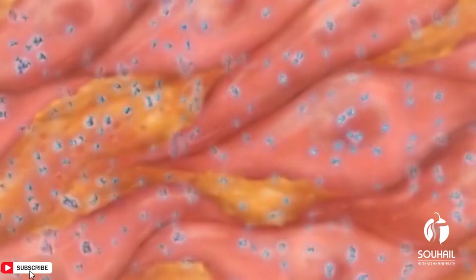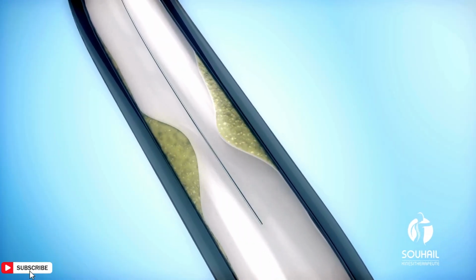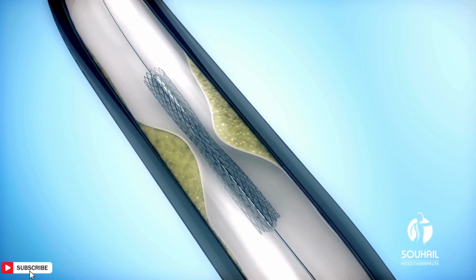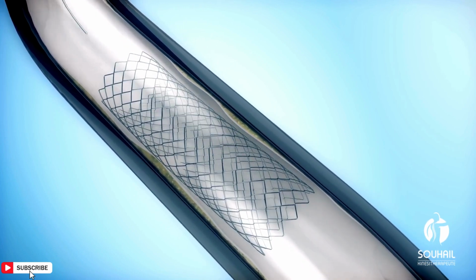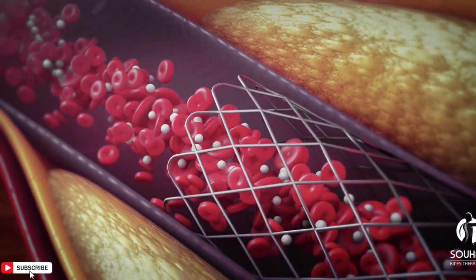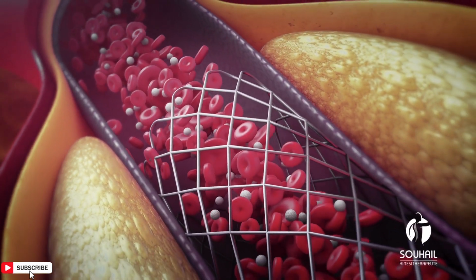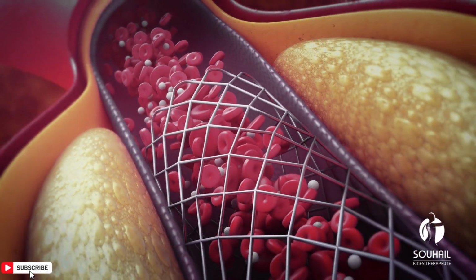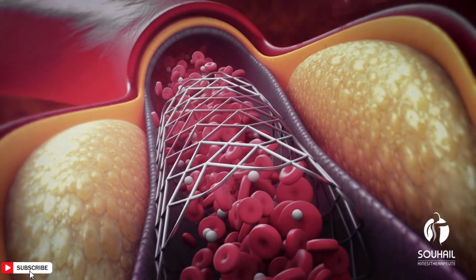Post-procedure. After the angioplasty is completed, the catheter and guide wire are removed, and pressure is applied to the insertion site to prevent bleeding. The patient may be monitored for a period before being discharged. Recovery. Recovery time after angioplasty is usually short, and most patients can resume normal activities within a few days. Medications to prevent blood clots and reduce the risk of restenosis may be prescribed.